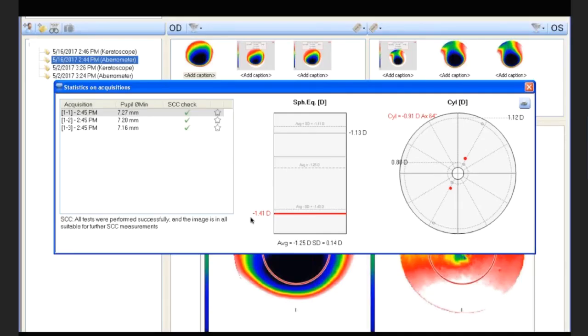Again, you're going to pull out your scans. You're going to right-click on one of your images, and you're going to select the scan you're going to use for treatment by choosing whatever diagnostic criteria you have for choosing your scan. We use the largest pupil size, and you're looking for similar findings here. That's a good pupil size and a consistent scan sequence. And again, most young patients with keratoconus will produce good scan information on the Pentacam scanner.